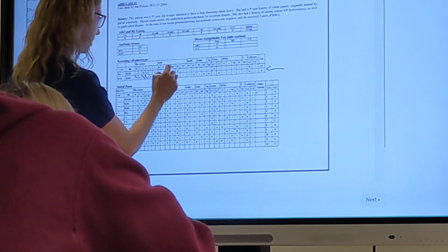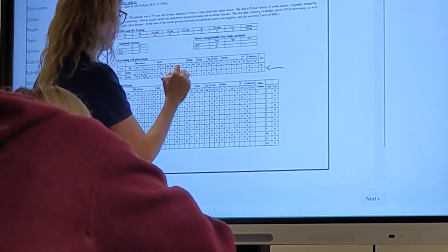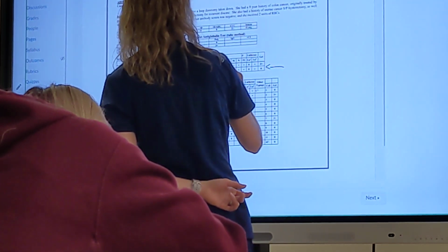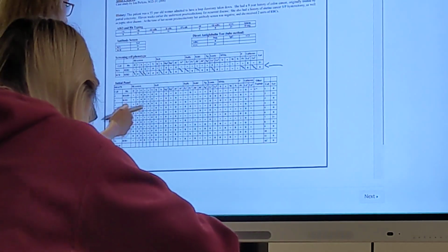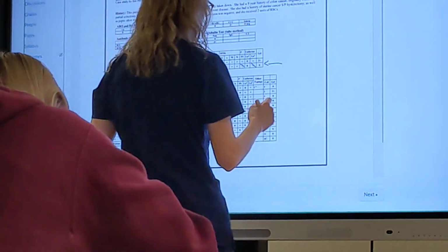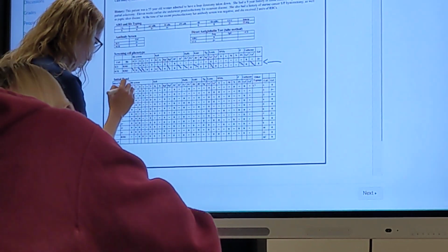Cellano, KpB, JsB, Wr(b), JkA, Lewis A, P1, Lutheran B. And so on my panel, I have a bunch of negatives. So go ahead and start marking them all.